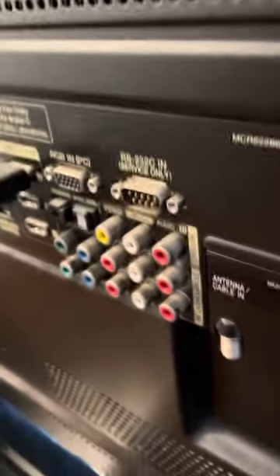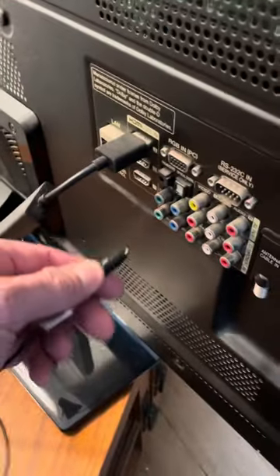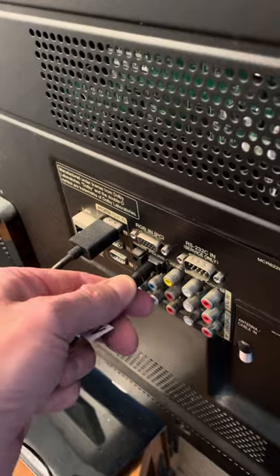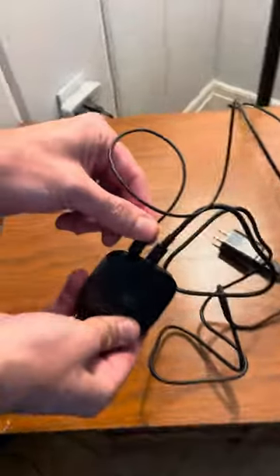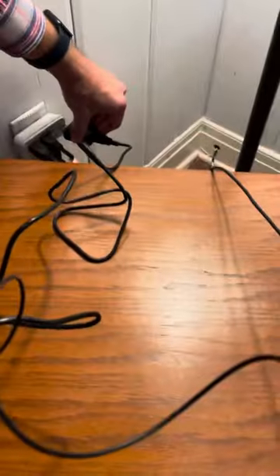Now I'm going to take this connector — let's pan out just a bit — and you're going to want to get this oriented correctly. Make sure it is oriented correctly, then it goes right in. It's connected to the back of the adapter right there, and now we're going to go ahead and plug this into a standard power source.